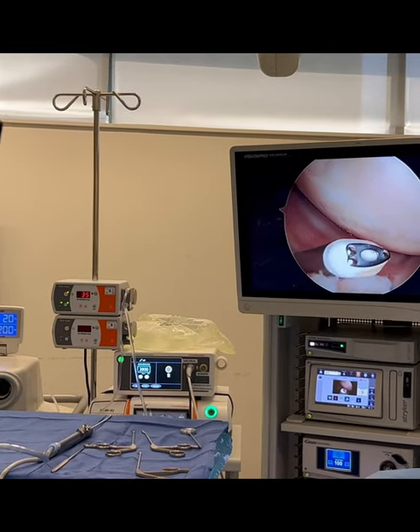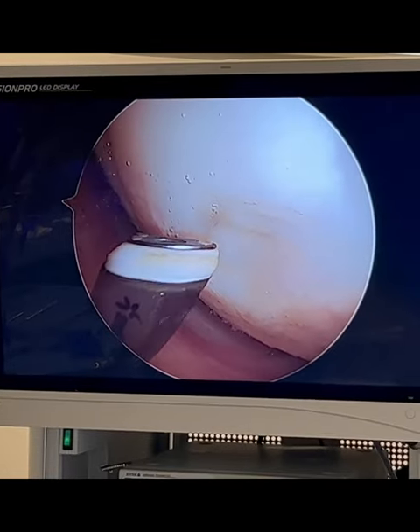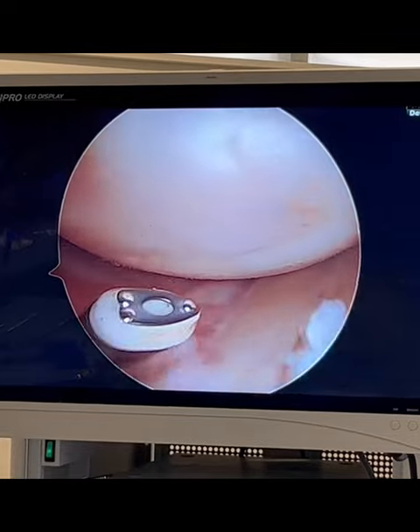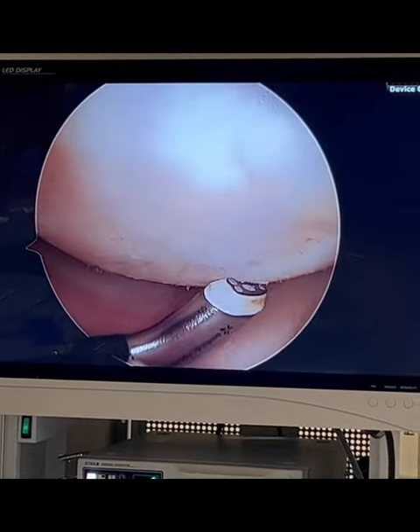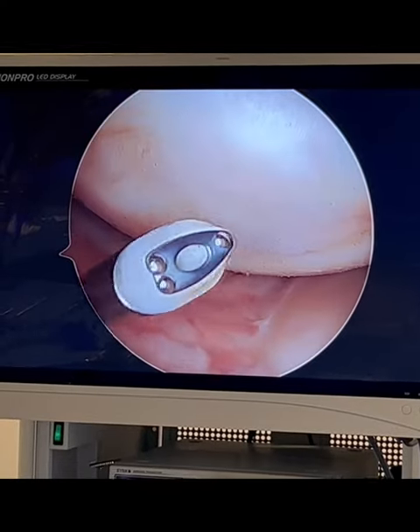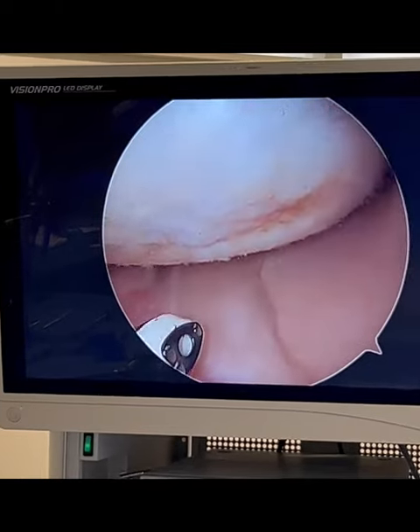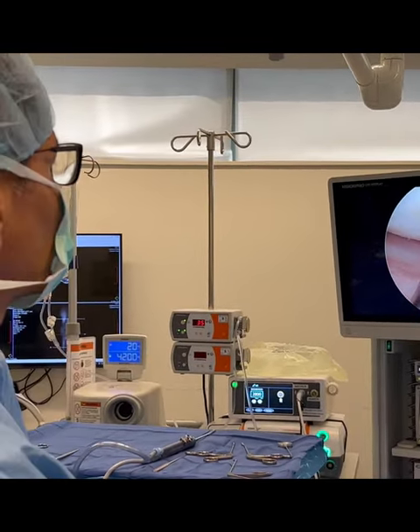I'm using the Smith & Nephew coblation device to gently remove, with very low heat, the edges. And that's what the after looks like — it's smoother. The edges are no longer lifting, so there'll be less symptoms and less swelling. Those are the expectations following chondroplasty of the knee for a patient that was having catching, locking, and swelling. I'm hoping that will make the patient a lot better.